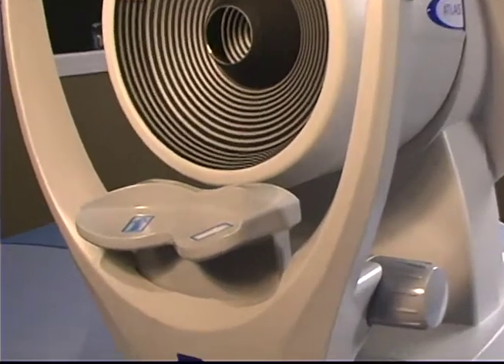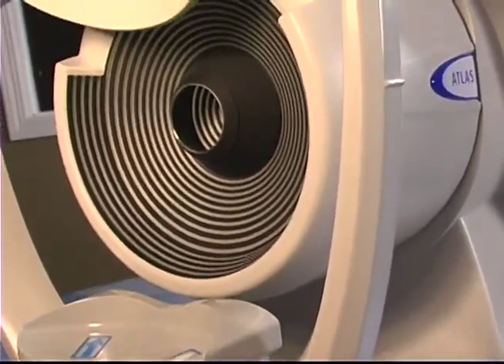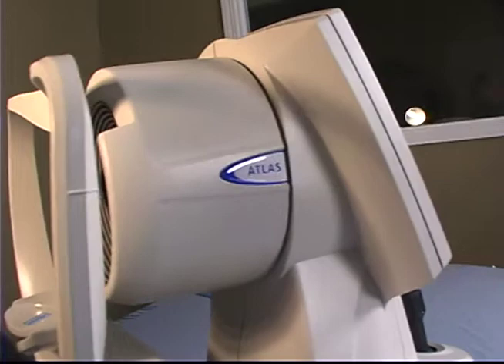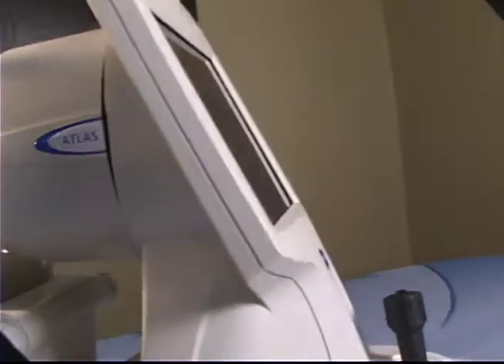The 22-ring placido cone presents a larger limbus-to-limbus field of view. This also enables superior alignment for greater reproducibility and accuracy. The Pathfinder provides a key tool for patient screening and pathology management.